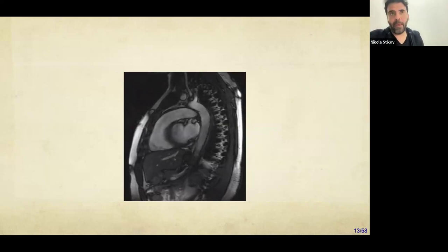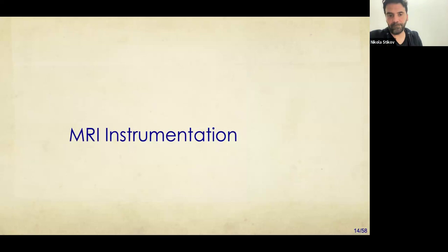Now, as I told you, MRI is safe. That's why it's possible to do MRI studies on healthy people. There's no dangers. That being said, MRI is slow. So to be able to capture a beating heart, these images are really sophisticated because the heart beats fast, and MRI usually takes its time with acquiring images. But it's pretty amazing that we can also do this, even though for cardiac imaging, there are all other kinds of applications. But MRI is the safe one. MRI is the one that doesn't really cause any side effects.